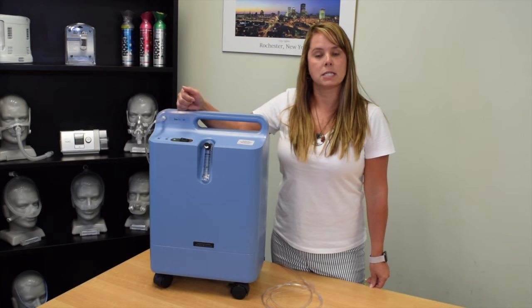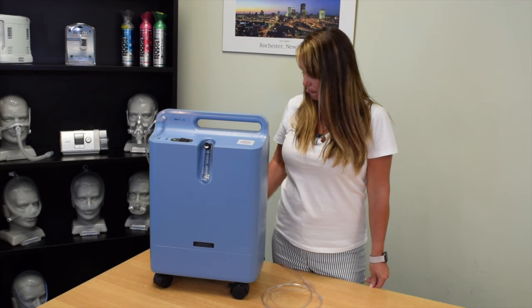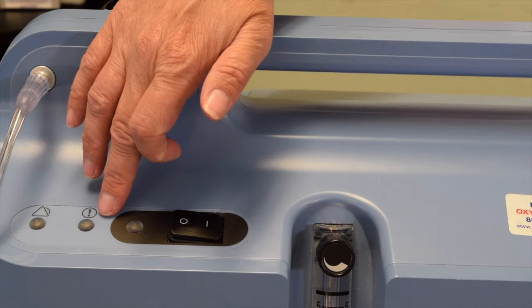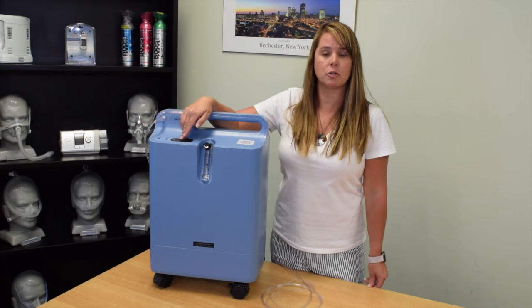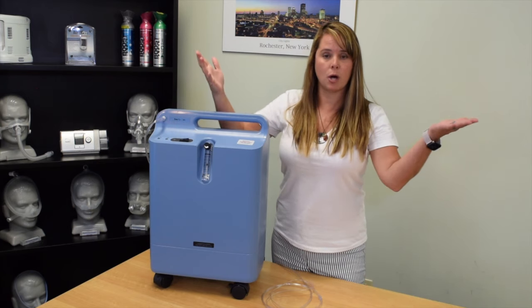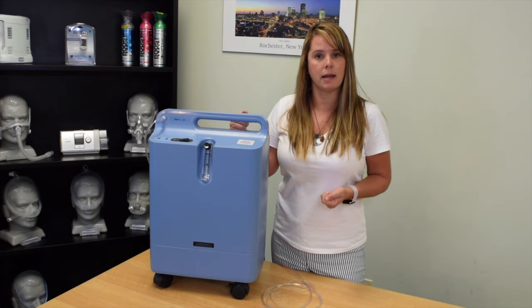The first issue we may experience with our concentrator is if for some reason the concentrator has lost power. If so, you're going to get this loud, audible alarm. You can see that we don't have any alarm indicators, but you can hear that audible noise, so we're going to go ahead and turn the concentrator off. Obviously if the power is out in the home, that is why your concentrator has lost power — you'll want to switch to your backup e-tank.